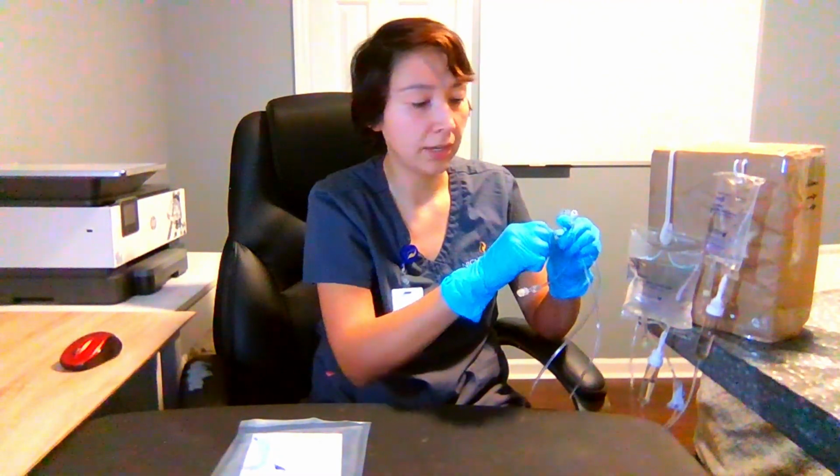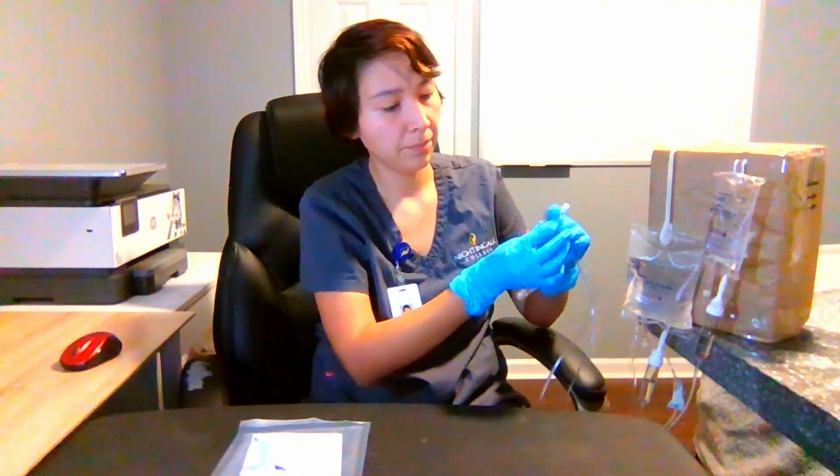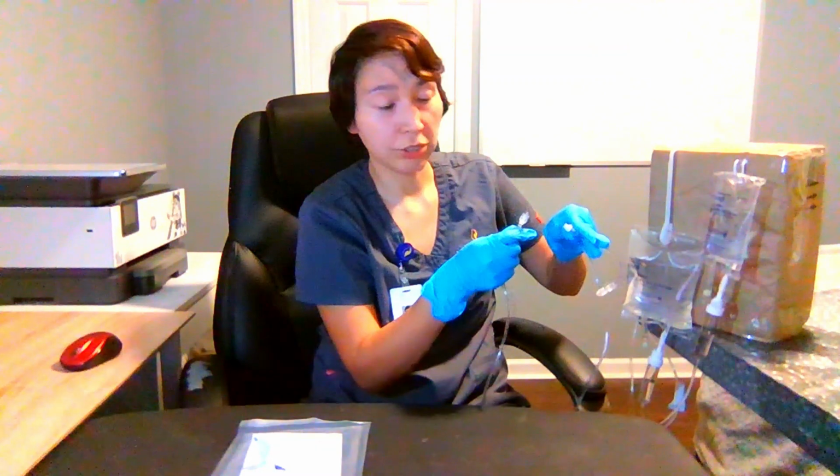Then remove the cap from the piggyback medication tubing and insert the cannula tip of the piggyback infusion tubing.